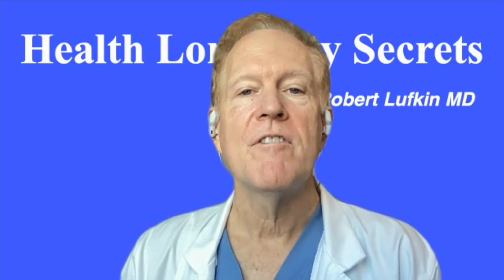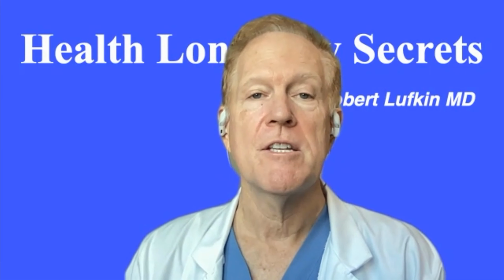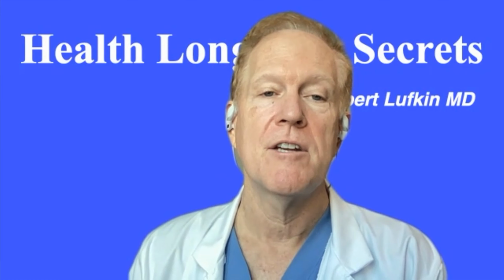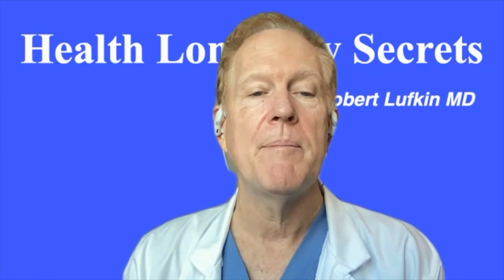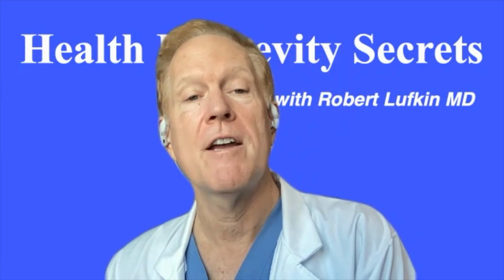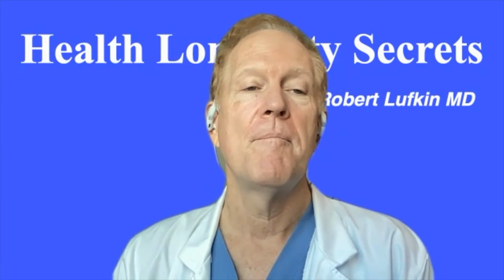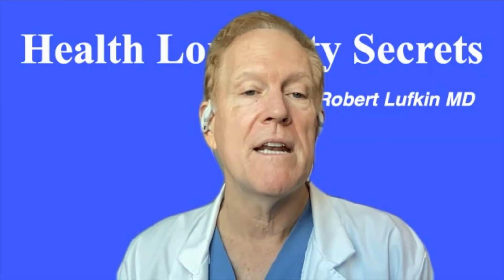Yeah, for a given weight, depending on how the fat is distributed into various body compartments, which is what the body composition MRI can show, you can have two people, and one is very healthy metabolically and one is very unhealthy metabolically, and you wouldn't be able to tell from looking at them or from their weight as measured by a bathroom scale.